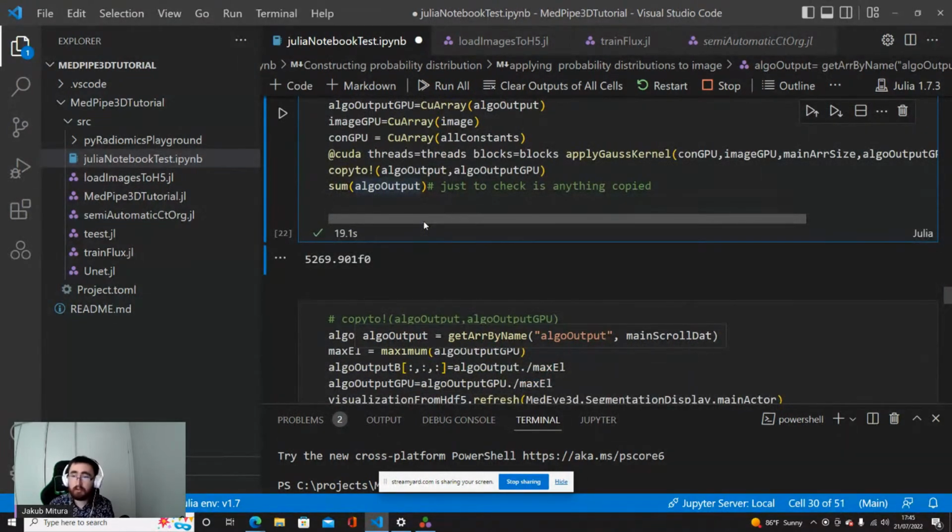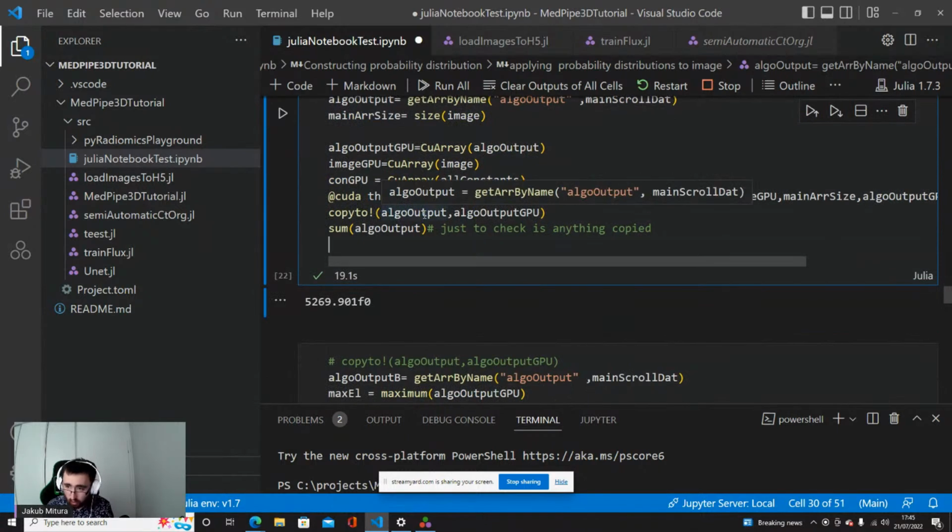And it's not optimized code, as you mentioned already. So it's not optimized code, and it's already very fast. If we would do it on the CPU, it would take, I suppose, half an hour if it would not be optimized. We still can optimize it and so on, but it would be very slow.